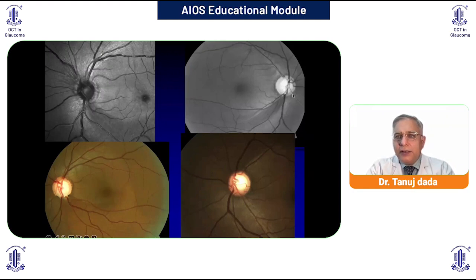And in addition, you should screen the entire neuroretinal rim and look for focal defects in the neuroretinal rim and associated retinal nerve fiber layer defects. So before using the OCT, you should become a master of interpreting the fundus photograph and do a dilated 90D examination of the optic disc and the surrounding retinal nerve fiber layer.